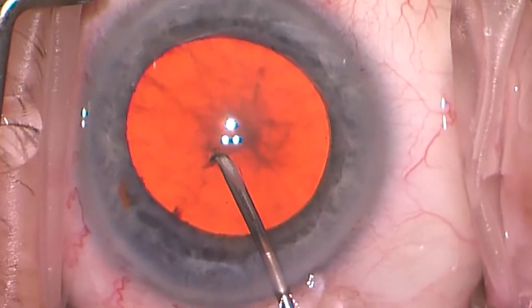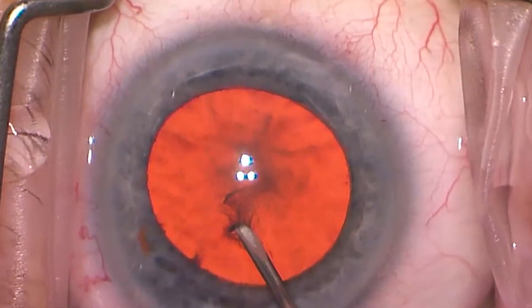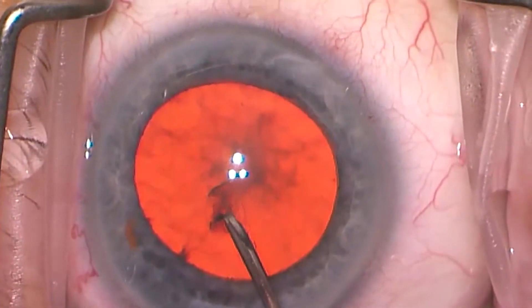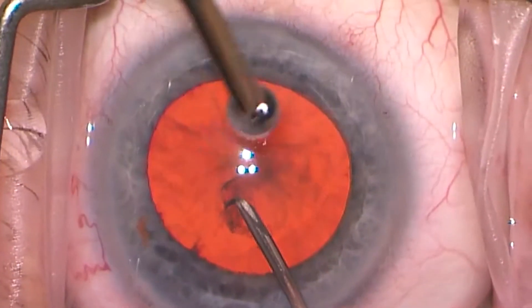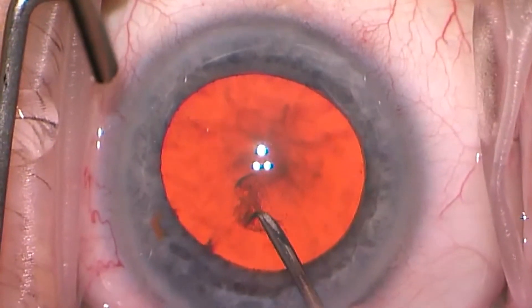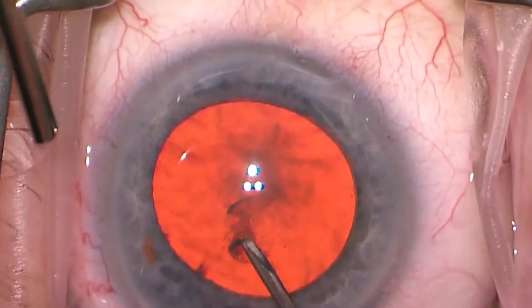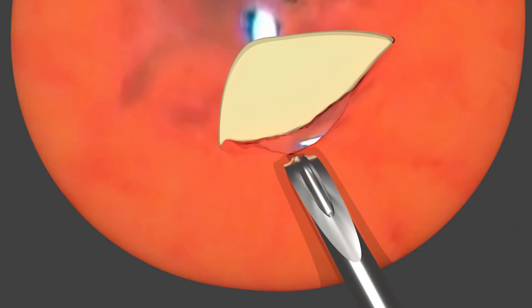Let's look back at the beginning of this video at about 30 seconds where the rhexis initiation really bogs down. I'm going to put on four of these 3D images where you can see why what is being done is not effective, and why it's taking 30 seconds to actually achieve the slit-to-flap conversion. Here is the first of those images — it almost looks like it's good, but what you should notice is that the cystotome is not engaging the flap; it's actually proximal to it.